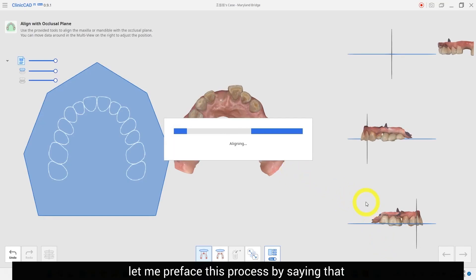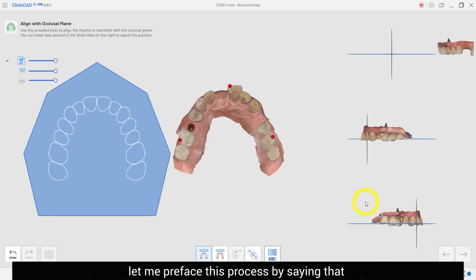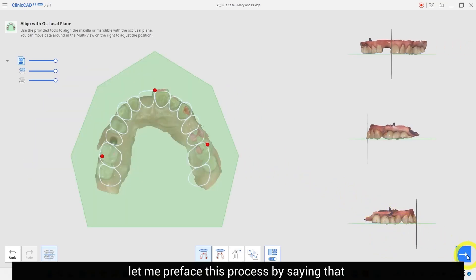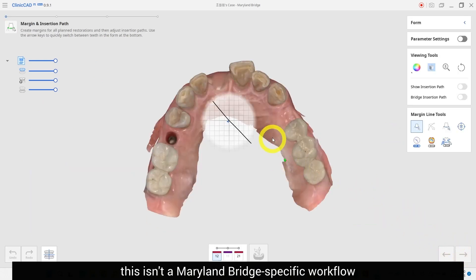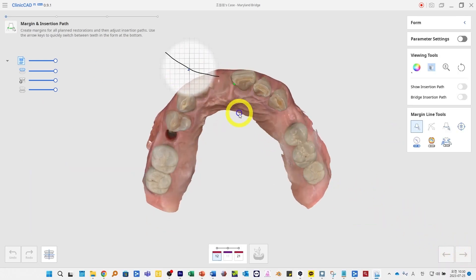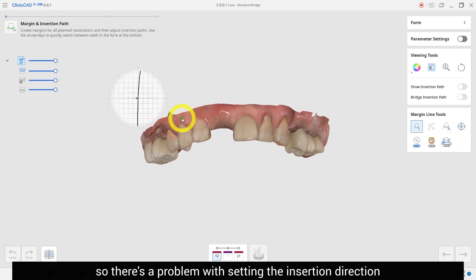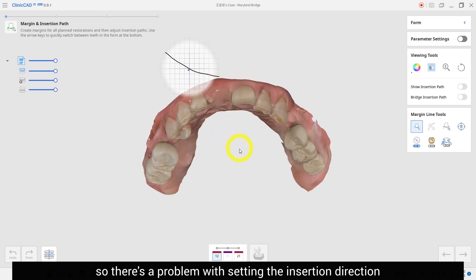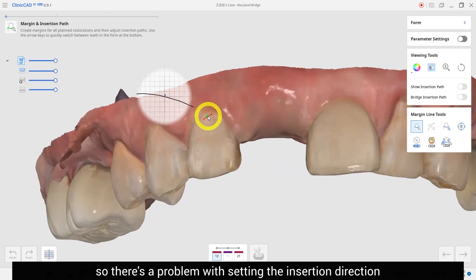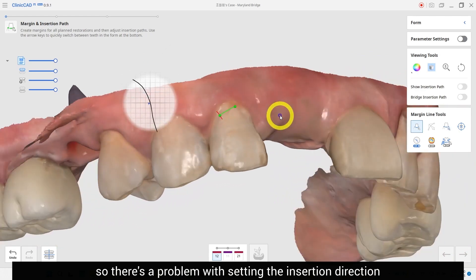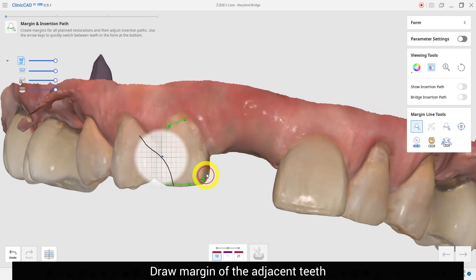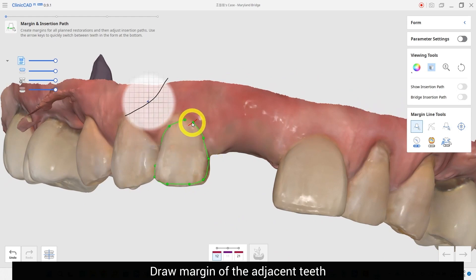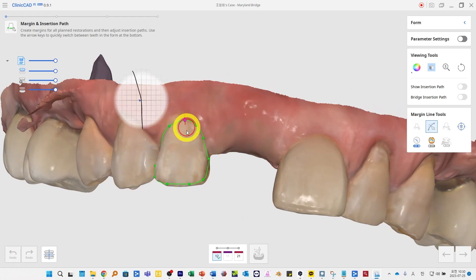Let me preface this process by saying that this isn't a Maryland bridge specific workflow, so there is a problem with setting the insertion direction.